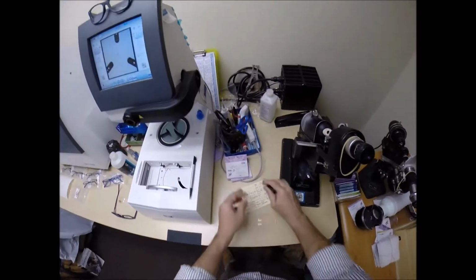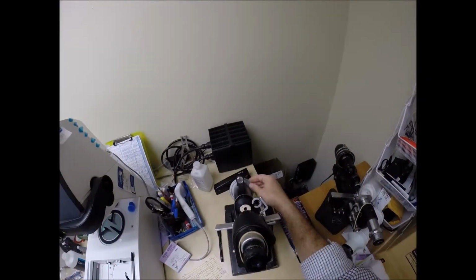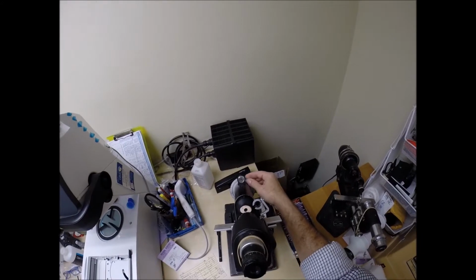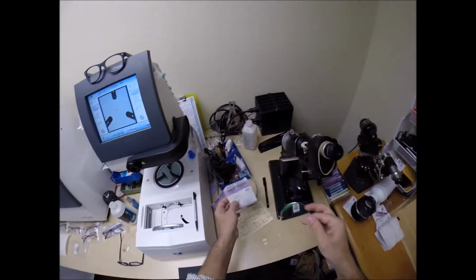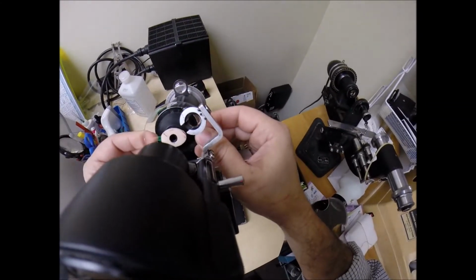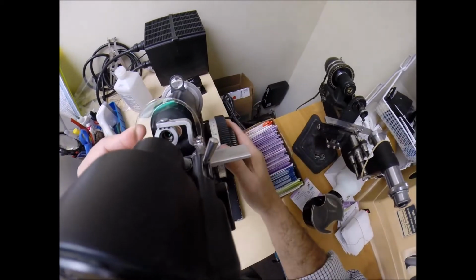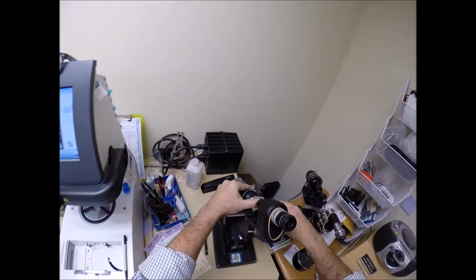Let's do the same thing now for the left lens, which reads plus 50 minus 2 at 10. We're going to spin the fine tune knob to 10, the astigmatic wheel. Take the lens out of the protective sleeve. We're still on plus 50. Same power in each eye. Different astigmatism correction. Find the spherical component. Check your astigmatism correction. That looks good.